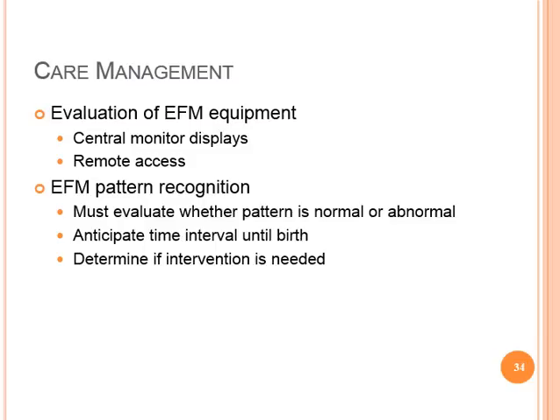Care of the woman receiving electronic fetal monitoring in labor begins with the evaluation of the electronic fetal monitor equipment. The nurse must ensure that the monitor is recording the fetal heart rate and uterine activity accurately and that the tracing is interpretable.